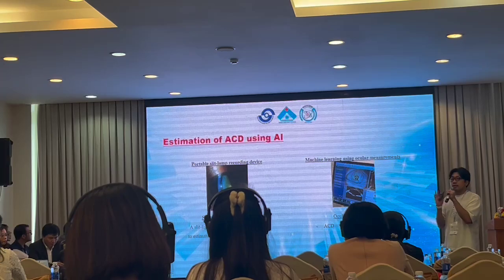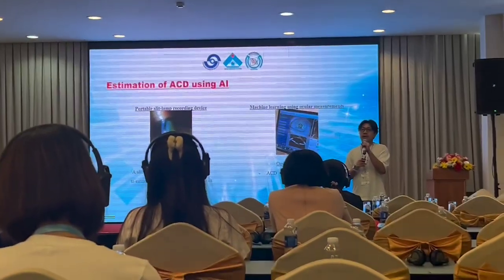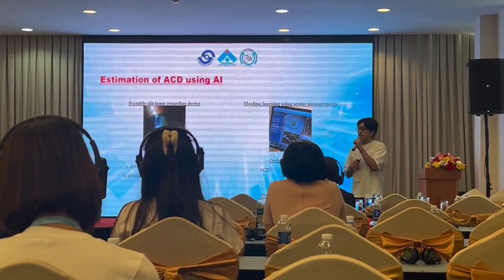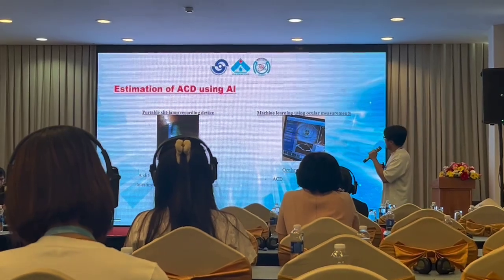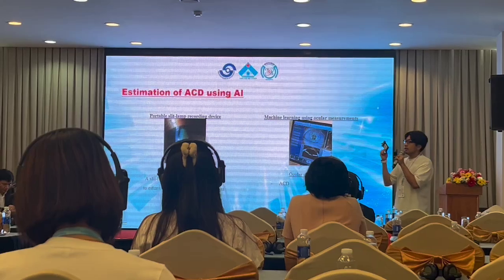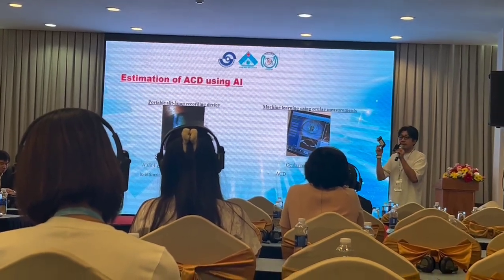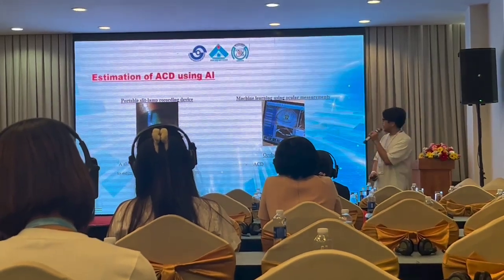Now, because those machines are huge, bulky, and unmovable, it is hard for us to use them in rural areas. It's very hard for us to bring them to outreaches, cataract surgery programs, anywhere in rural places. So this is the idea: if we can use this tool to get the anterior segment image of the patient's eye, and an algorithm to estimate anterior chamber depth, it can have a huge value as well.